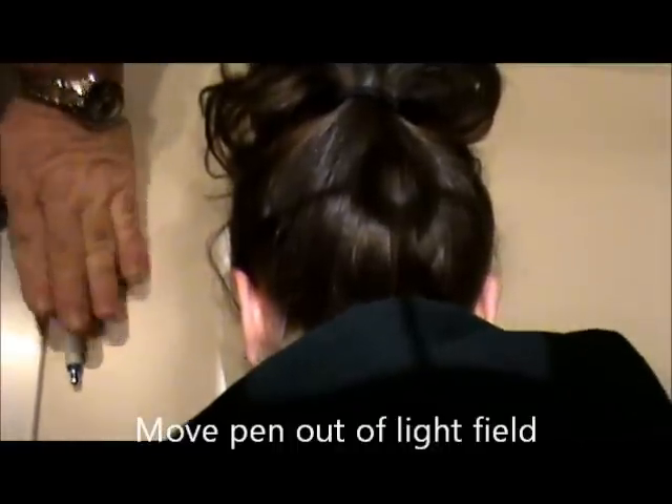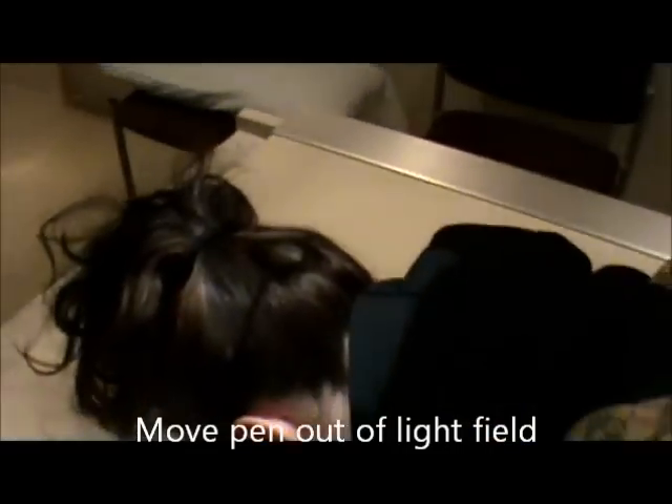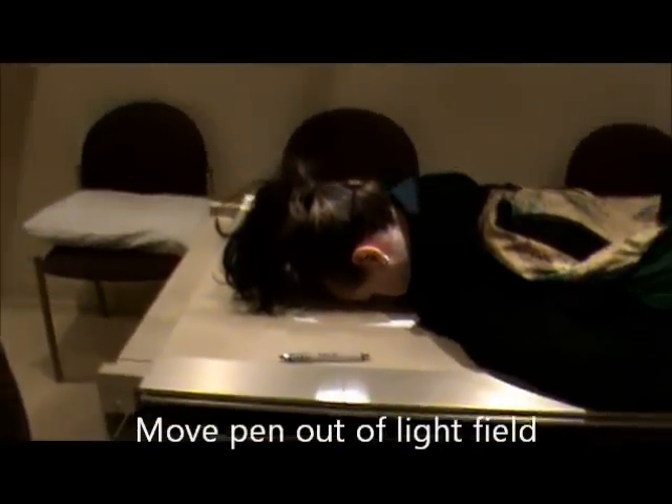I'm getting my centering line on my ink pen to show I'm at the level of the glabella. I've recentered to my film. We're going to use either a right or left marker. The collimation should be to the top of her head and to the skin margin side to side. Her right is now on this side, so I'm moving my right marker accordingly. This is the preferred PA view — less radiation to the eyes and less magnification, because the frontal bone is now closer to the IR.